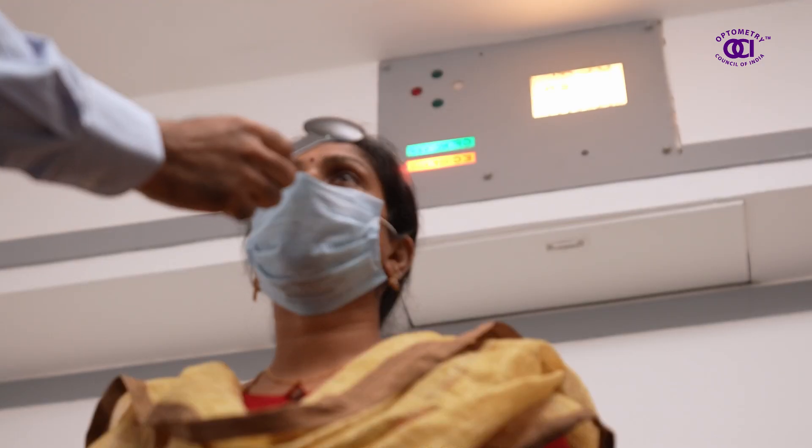Once done, the optometrist checks your current vision.